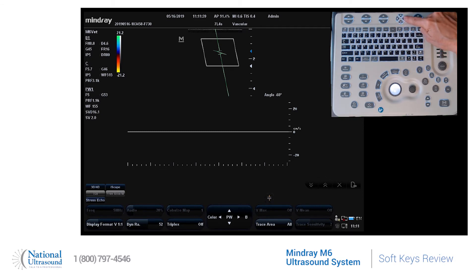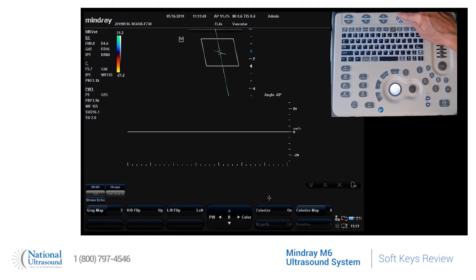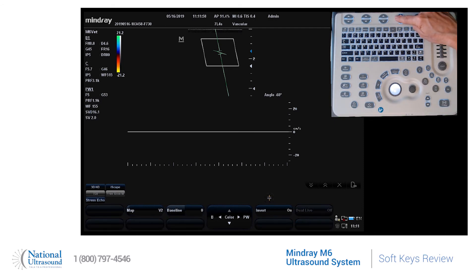If I press this arrow to the right, I will get to B mode parameters, and then press up or down to scroll through the options pertaining to B mode. If I press the left button, I will get back to PW Doppler. If I press the left button once again, I will now have color parameters available.